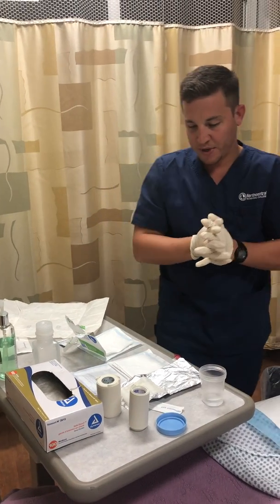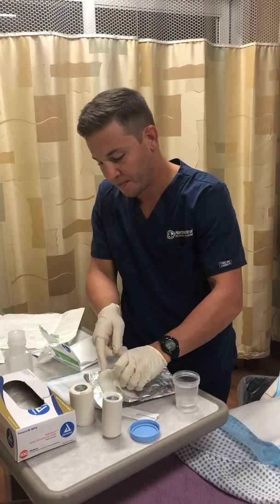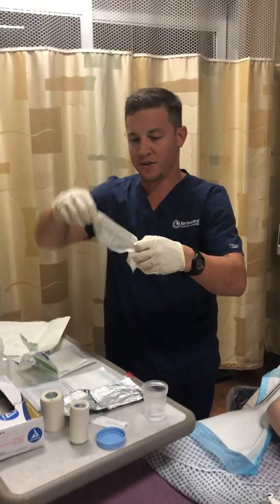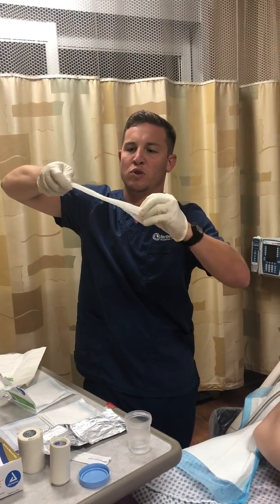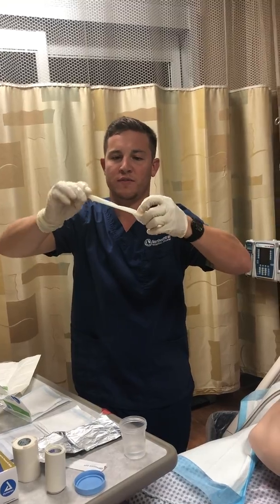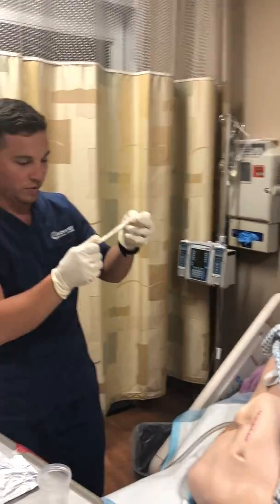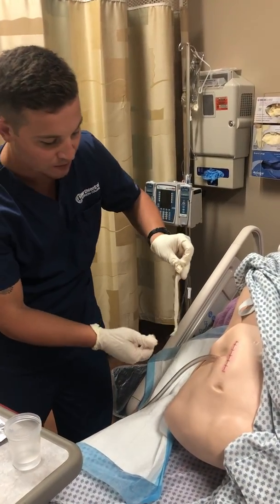Okay, so our next step here is that we're going to grab our Vaseline gauze. And we're going to make what's called a ribbon, like this. It's kind of a twirl like that. We're going to remain as sterile as possible.